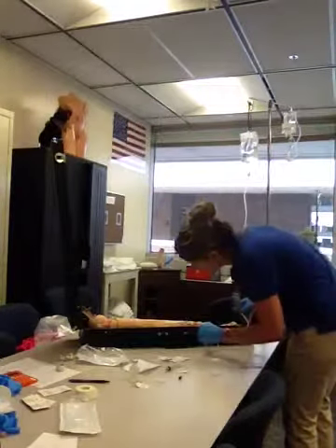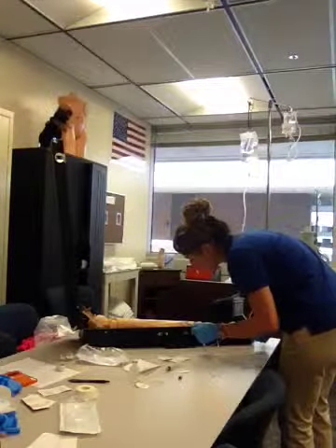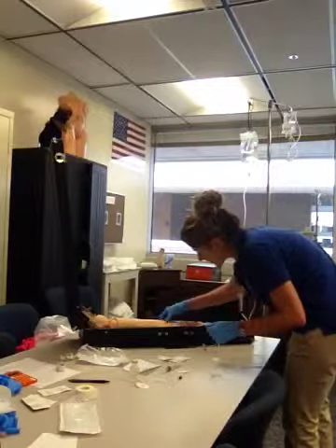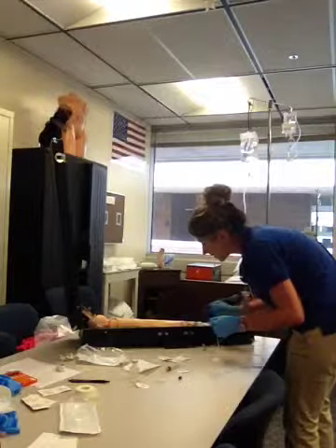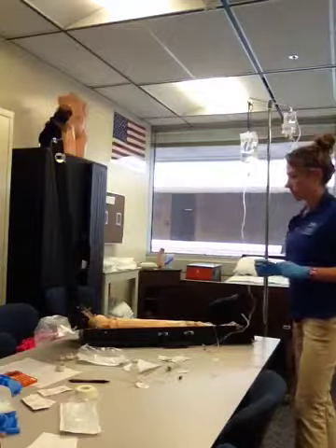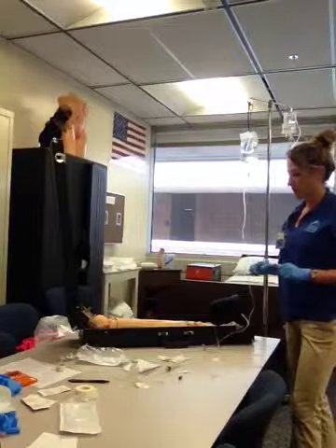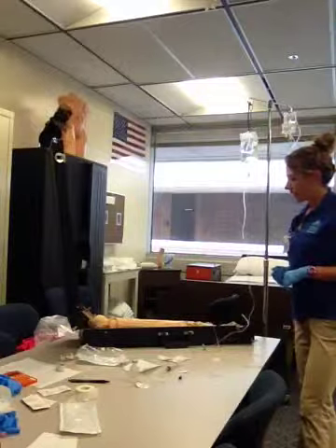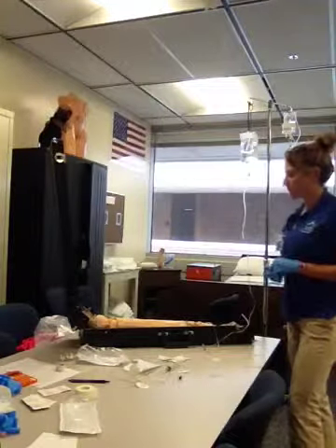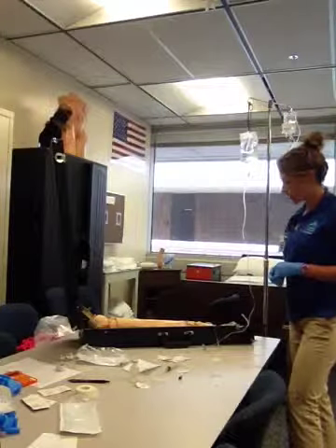I'm going to assess the access site for any redness, any drainage, any swelling, any coolness, and it looks good. I'm also going to reassess Mrs. White for any reaction to the drug, and she looks good, and I'm going to tell her to call me if she has any concerns or any reaction.